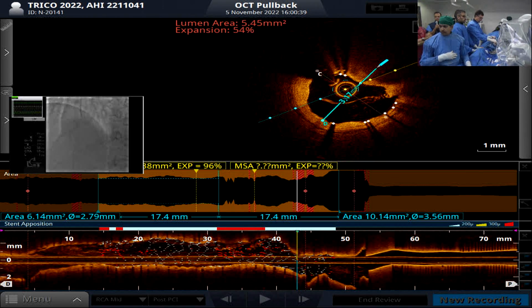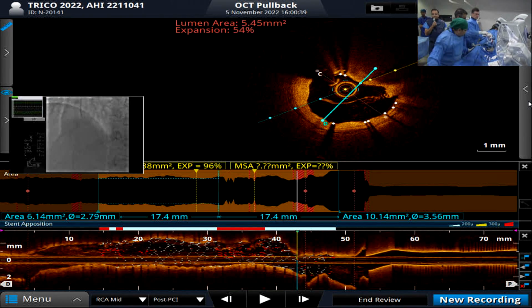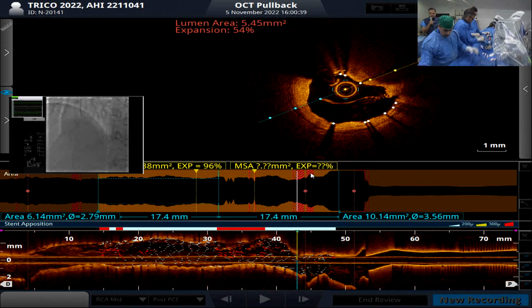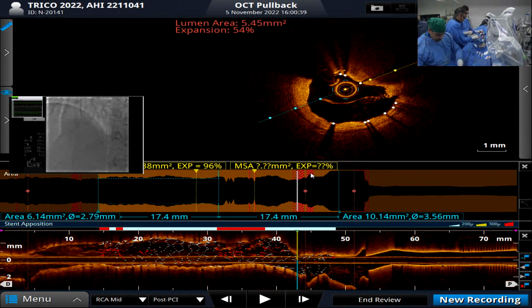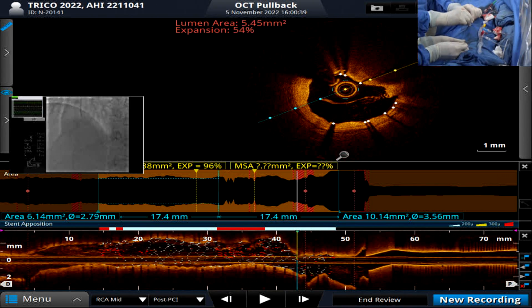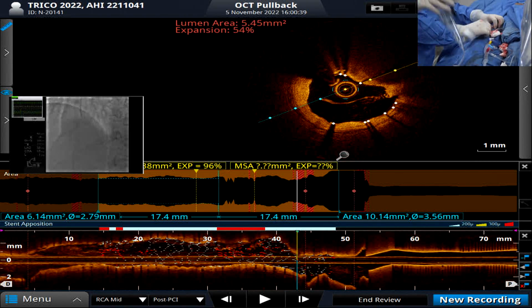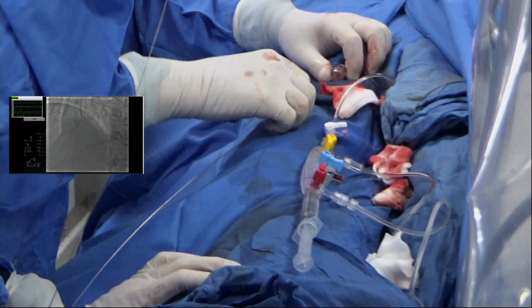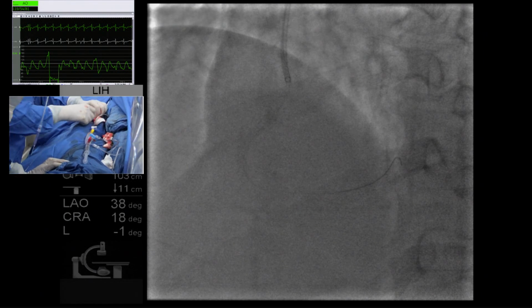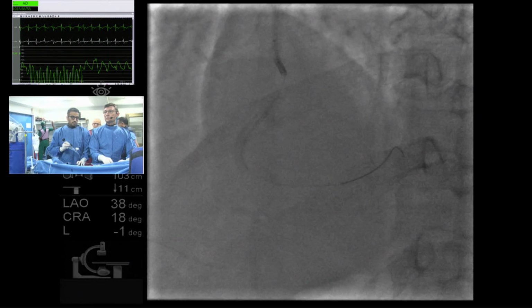Here, from 11 o'clock to 3 o'clock, we have a very thick plaque, and the opposite side is almost normal. Only a small amount of fibrous intimal hyperplasia, right? Sure, absolutely. So 20% is your maximum, quote-unquote, under-expansion that you would tolerate in a normal circumstance. Right, generally speaking. If there is a lot of eccentric calcium, sometimes 78% or 77% should be okay.